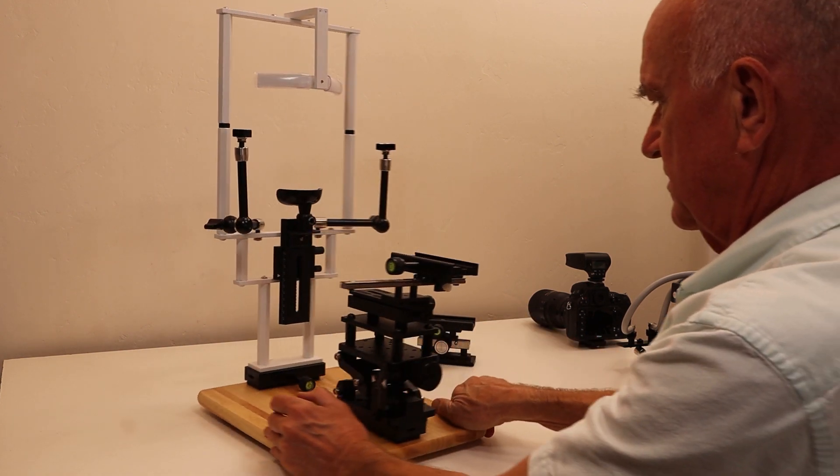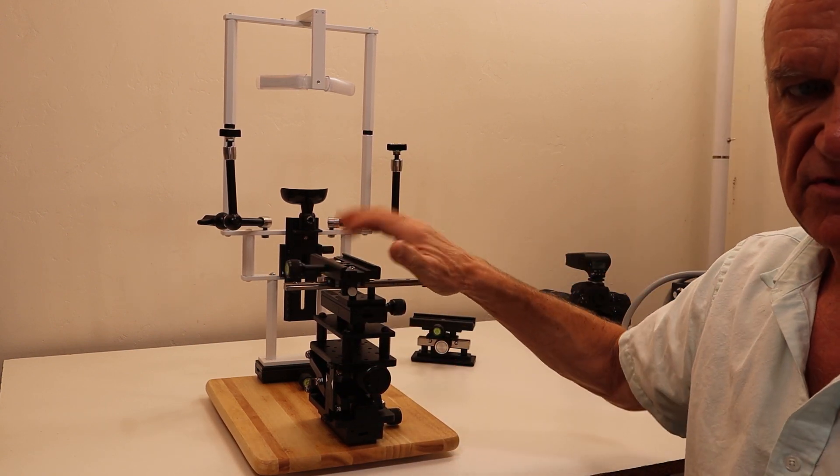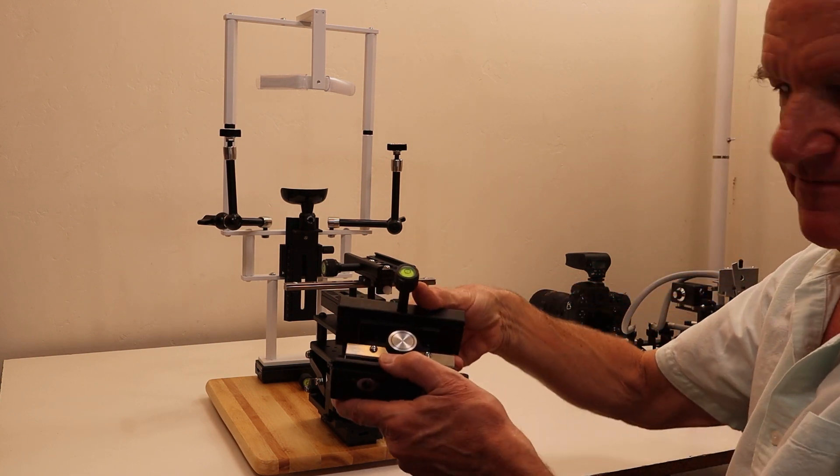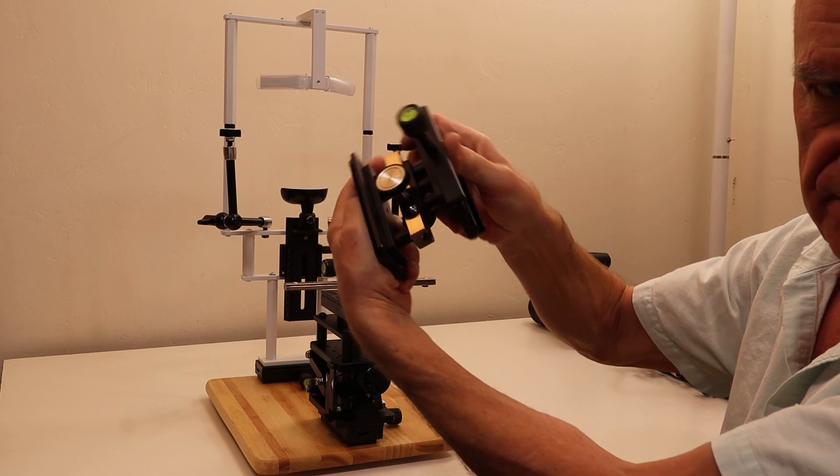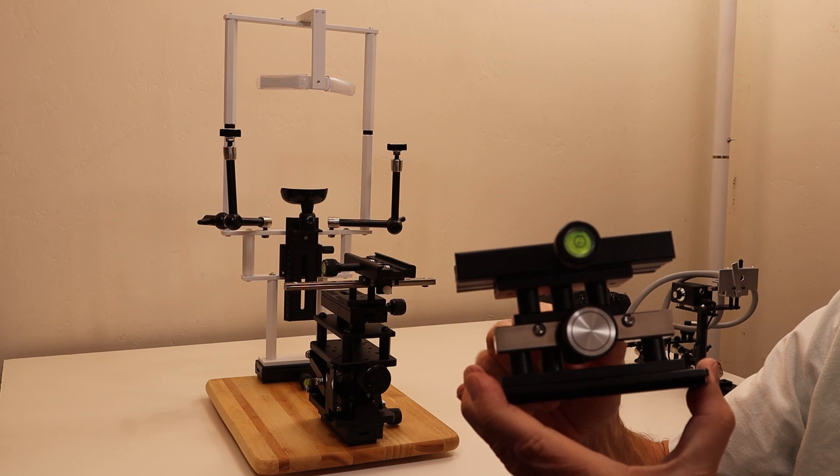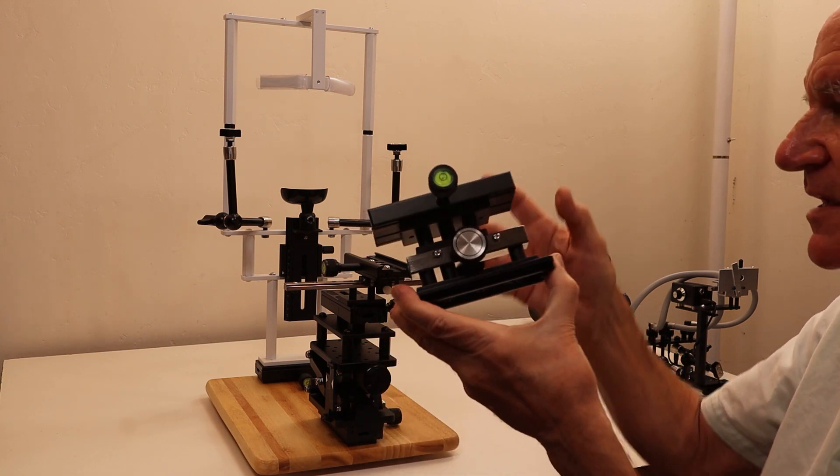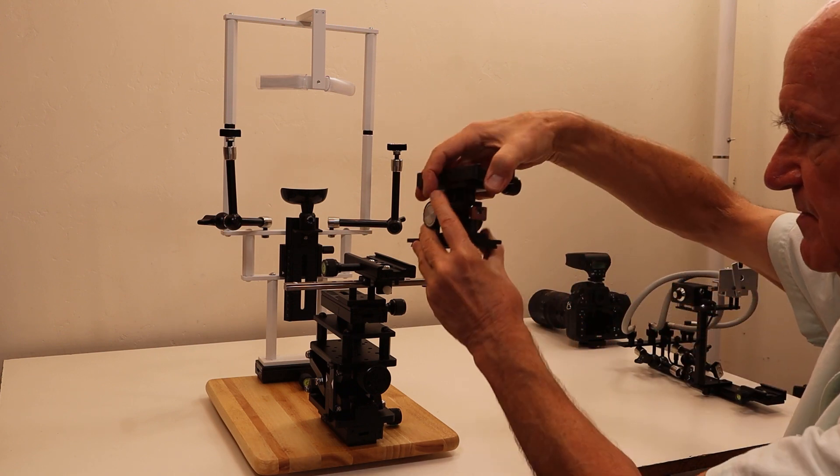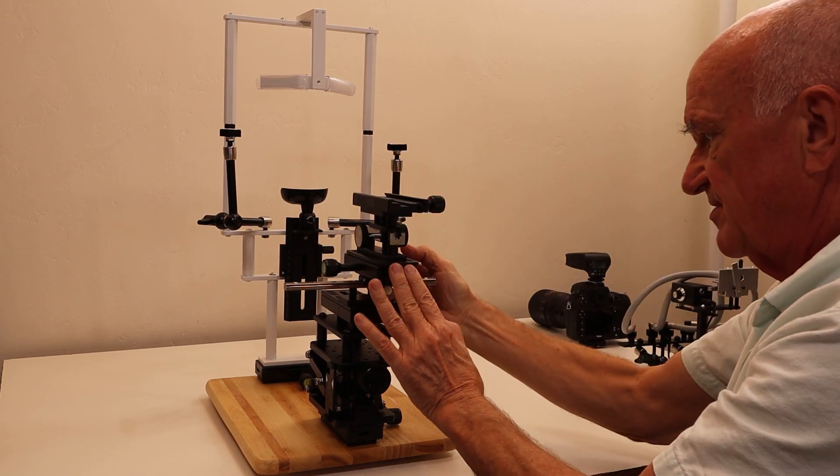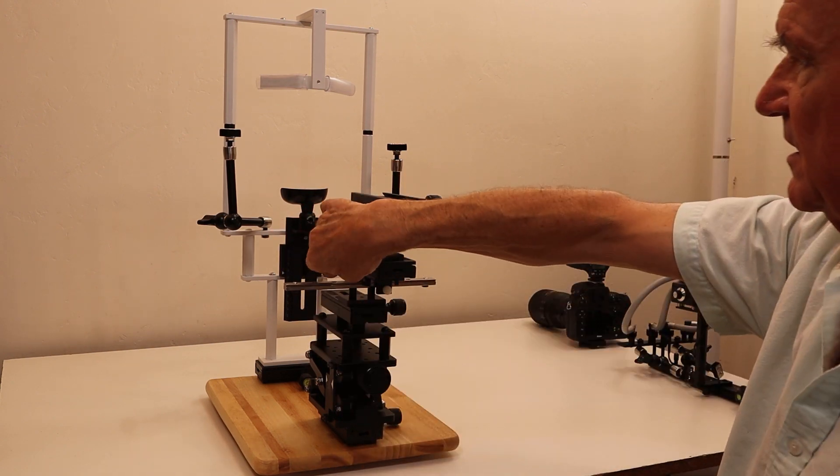The last part, number five, is the focus track. This is a new design with a very smooth precision mechanism with a knob on each side. It can go on either way - I usually put it opposite of this knob. You slide it in until it's flush and then tighten that.